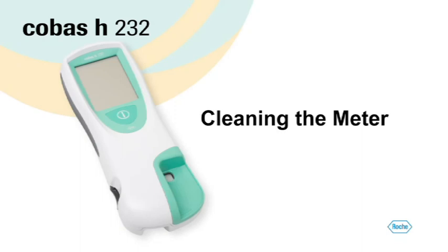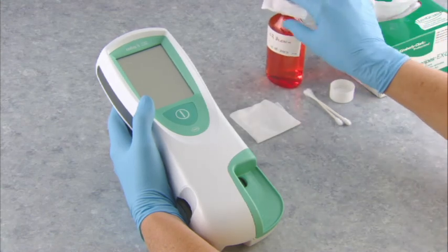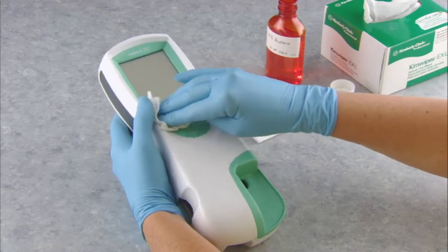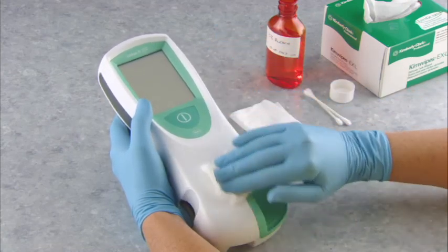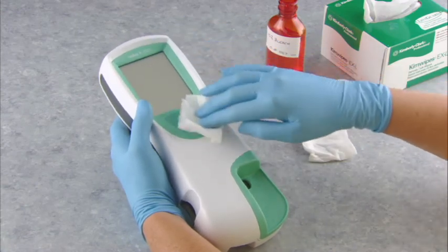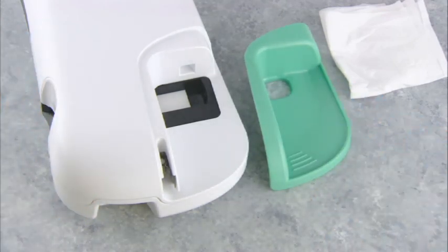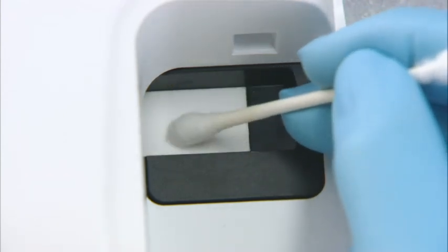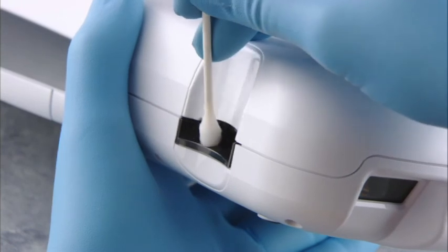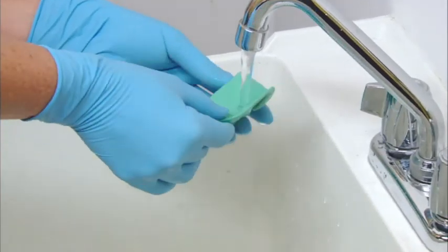Now let's look at how to clean the Cobas H232 meter. First, turn the meter off and remove it from the handheld base unit if required. Use a lightly moistened lint-free cloth, gauze, or cotton swab with a 1:10 diluted bleach solution or a 70% isopropyl alcohol solution. For other suitable cleaning agents, please refer to the operator's manual. Then dry the meter with a fresh tissue. Do not spray anything on or into the meter. To clean the test strip guide, remove the measurement chamber cover by pulling the cover horizontally from the meter. Use a lint-free cloth, gauze, or cotton swab to clean the easily accessible areas. Do not insert any objects into the test strip guide, as doing so may damage the components. Let the strip guide dry for 10 minutes before replacing the cover. To clean the test strip guide cover, you can rinse the cover under running water.